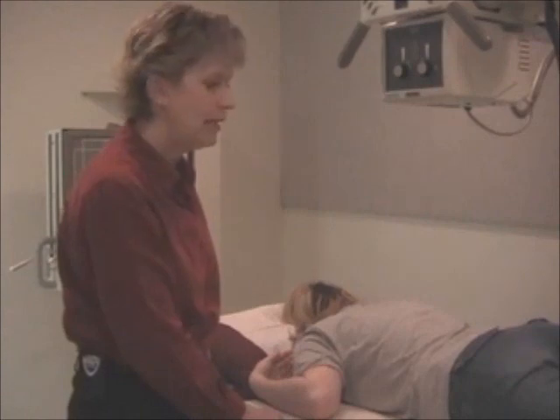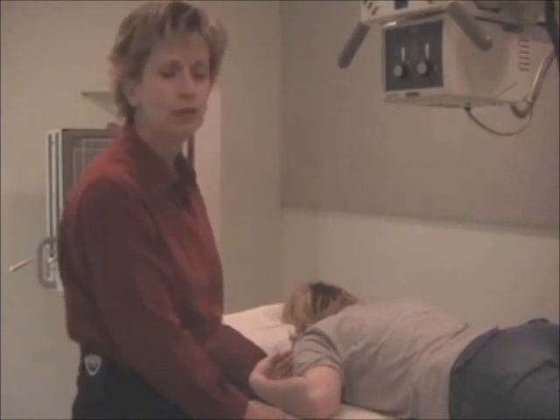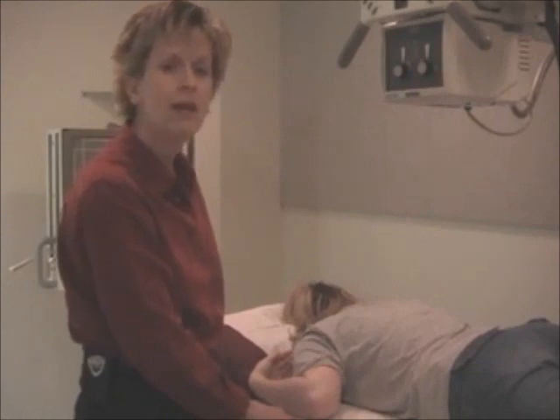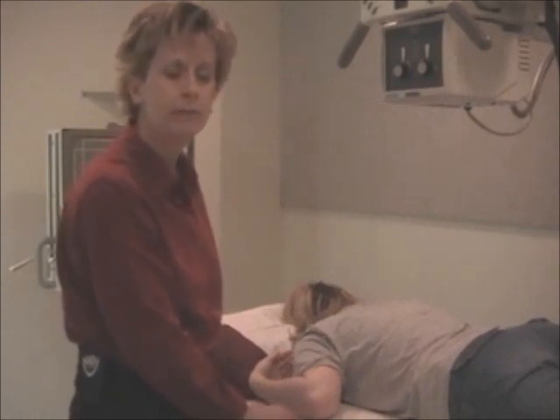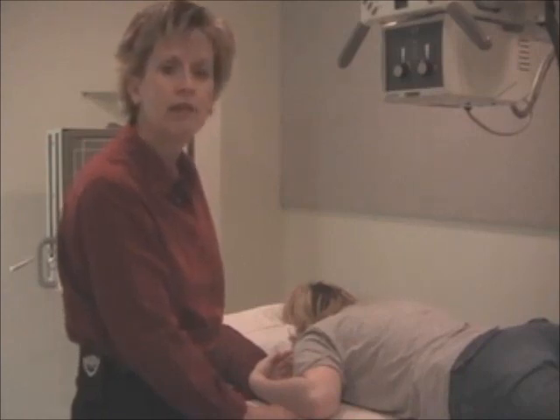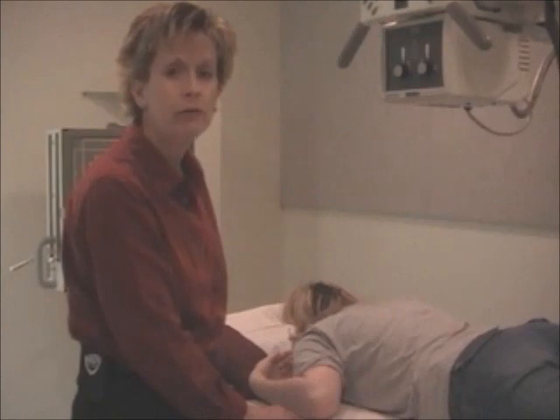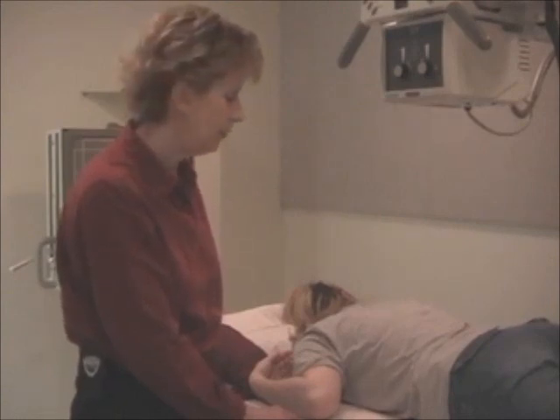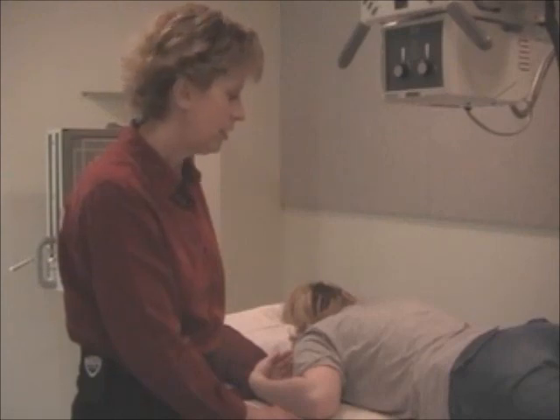And one of the best hints that I can give you is to make sure the patient knows that this exam may take a while, that the actual length of the exam has nothing to do with you or how busy your department may appear to be. It is solely dependent upon how long it takes the barium to reach the ileocecal valve, and every patient is different. Could be an hour, it could be 12 hours. So make sure they understand it, and then keep the patient posted as to their progress of the barium following down into the small bowel, reaching the ileocecal valve.